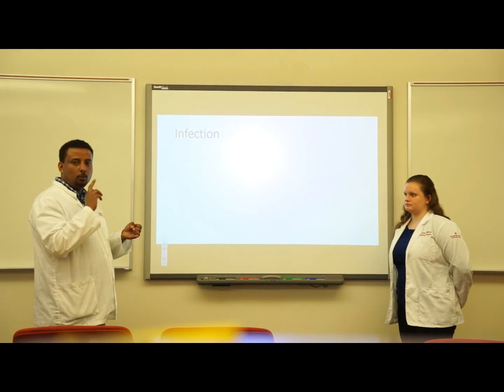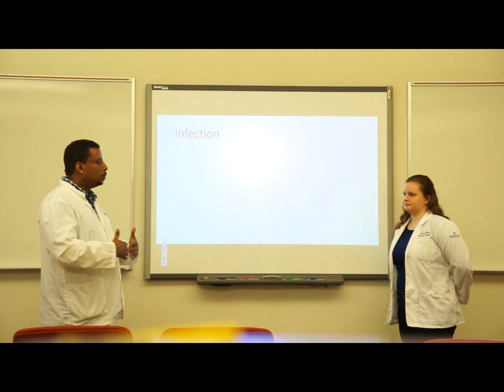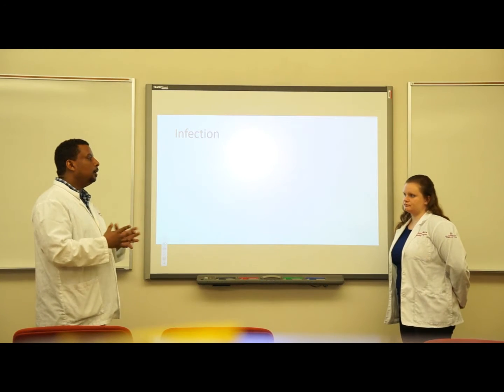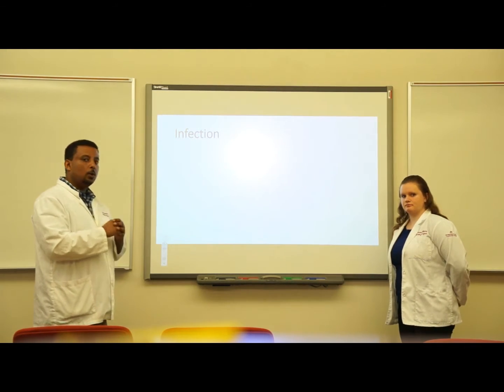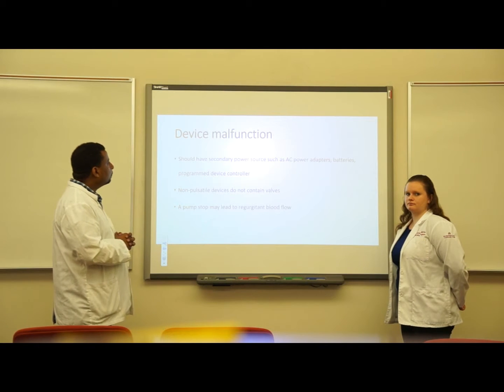So we can teach them to measure their temperature daily, assess the drive line, and see the temperature, the warmth, and assess. Educate them on what the drainage is and things like that, so that they can effectively tell us what has happened. And as long as they are within our care, we make sure our patients are free from infection.